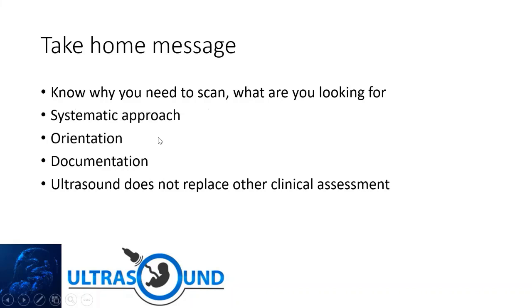So my take-home message for you is you need to know why you need to scan the patient, and you need to know what you are looking for. Always do it in a systematic approach, and you need to know your orientation so that it is easier. If you don't know your orientation, you will never know what you are doing. Documentation is important. You need to write down what you see, what you did not see as well. And last but not least, ultrasound does not replace other clinical assessment. It is just an adjunct, a very useful adjunct, but it does not replace your clinical assessment. All right, with that, I thank you.